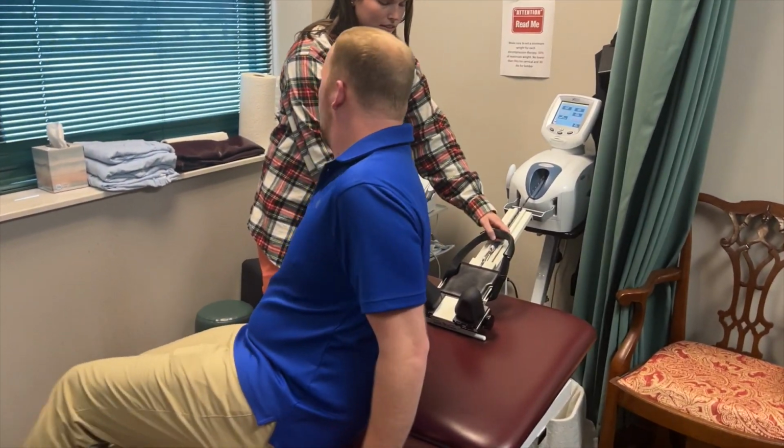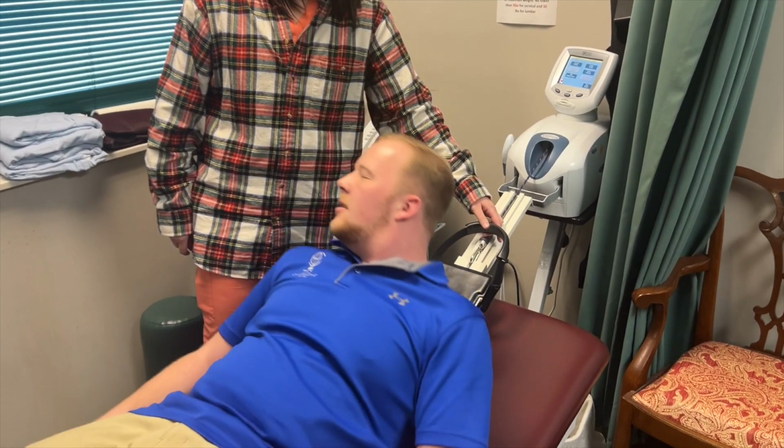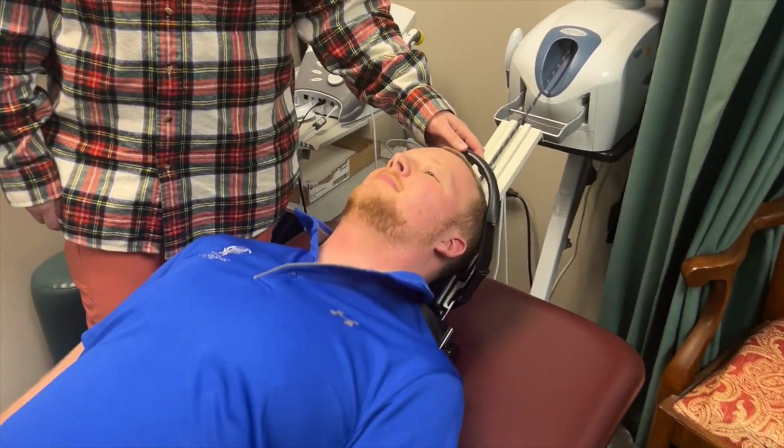So we're looking at the two main areas where disc bulges can take place, which is the lower cervical spine and the lumbar spine. Both of those are the most frequent that we use, but you can also do things such as distraction for the wrist, which is good for carpal tunnel.